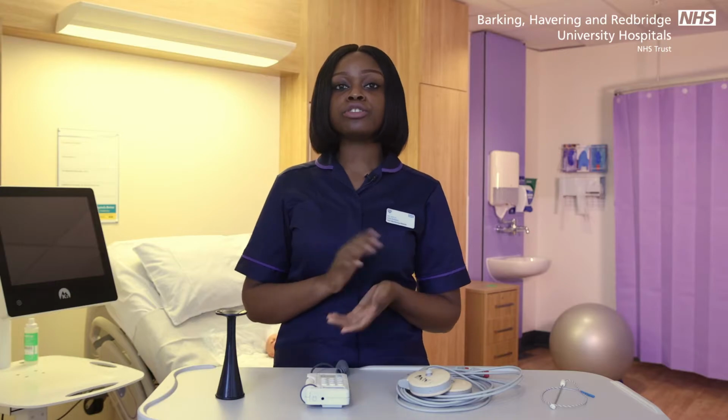During labour, when the womb contracts, the blood does not flow as freely through to the placenta and through to the baby, and this may cause reduction of oxygen supply. This is completely normal and most babies can adjust without any problems. If your baby is having any difficulties in adjusting, this may be reflected in the pattern of the heartbeat.